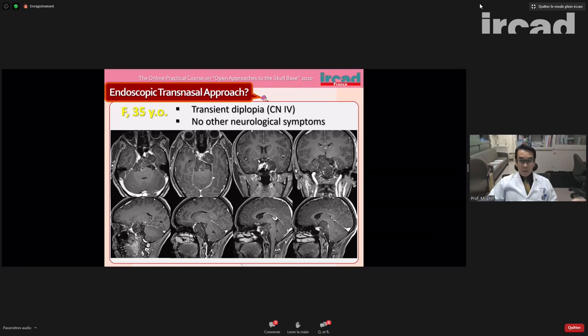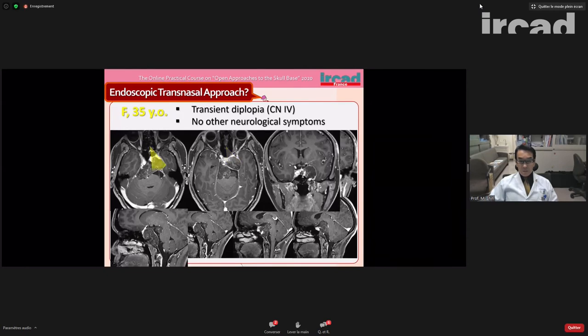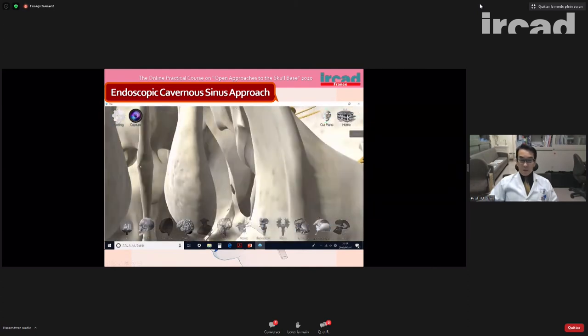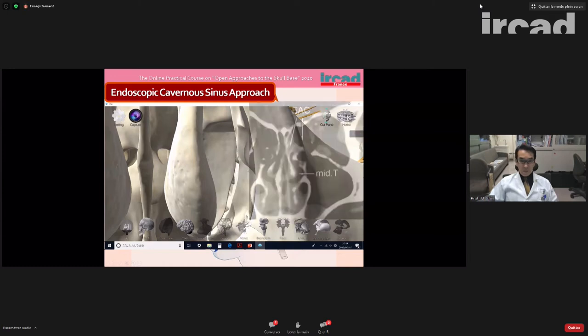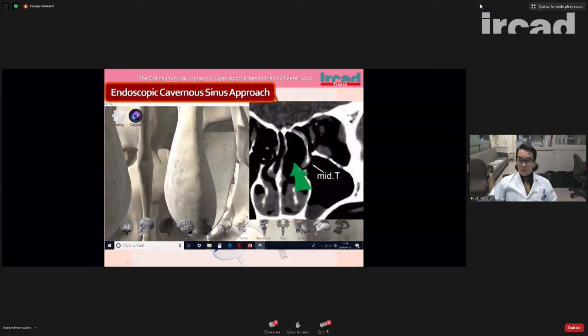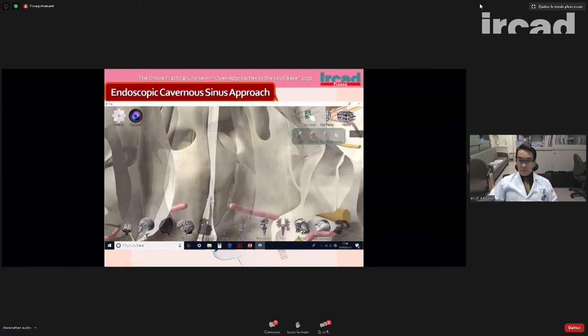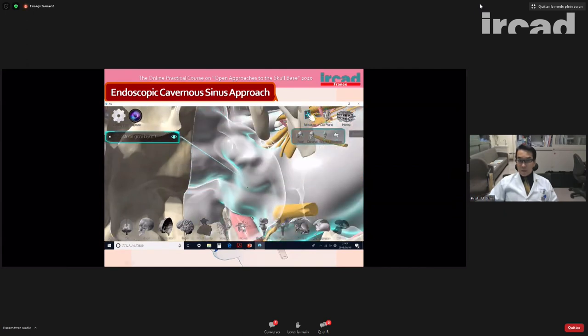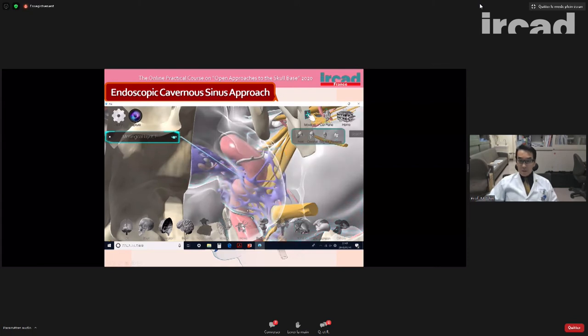So when I think about this case, first we start with the transcavernous approach like this, the endoscopic cavernous sinus approach. When we see this picture, the cavernous sinus is located lateral to the sphenoid sinus. So we remove the ethmoid sinus and septums, and we retract the middle turbinate laterally. Then we go into the sphenoid sinus, and the sella is here, and the cavernous sinus is located here, lateral to the sphenoid sinus, like this.